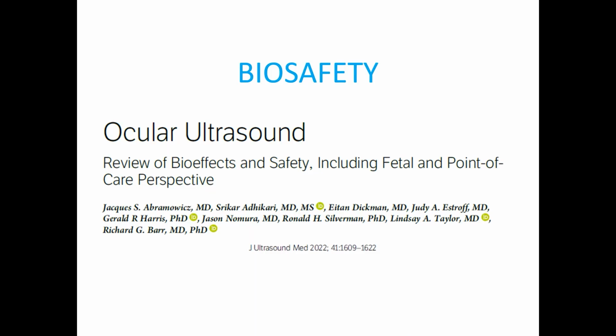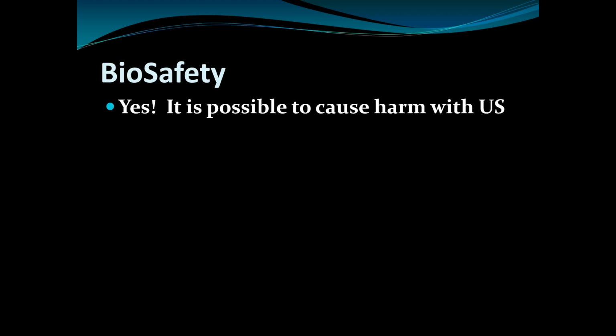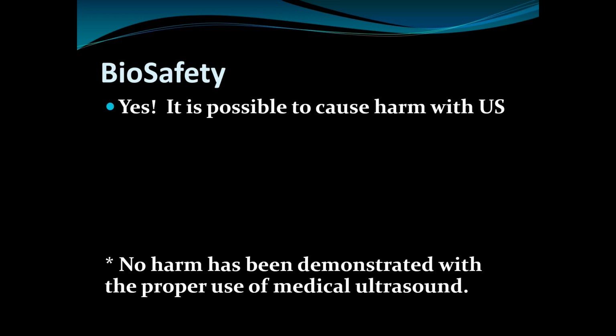So biosafety, and there's a couple places in ultrasound where biosafety is a real consideration, like with fetal ultrasound in the first trimester, and then ocular ultrasound is another place, because we are looking at really small parts, and the anterior chamber, which is filled with fluid, is really susceptible to potentially being damaged. So this was an article that looked at that, and there were a number of emergency medicine ultrasonographers who were looking at this. So yes, it's possible to cause harm with ultrasound. I will just say with a caveat that no harm has been demonstrated with the proper use of medical ultrasound. But it is possible, and we'll talk about how you can cause harm and how to prevent it.